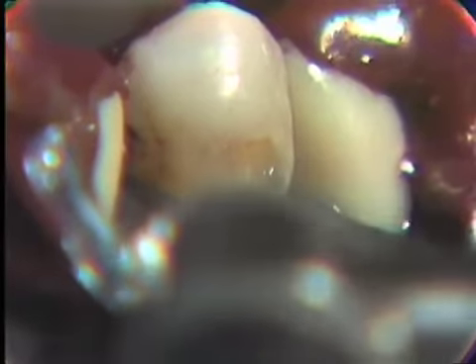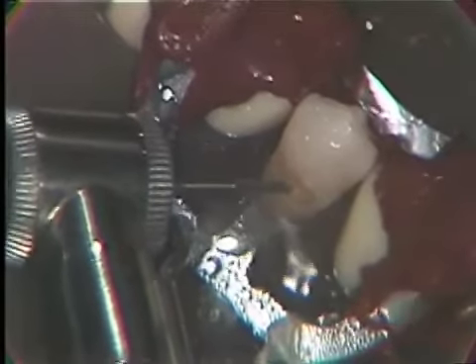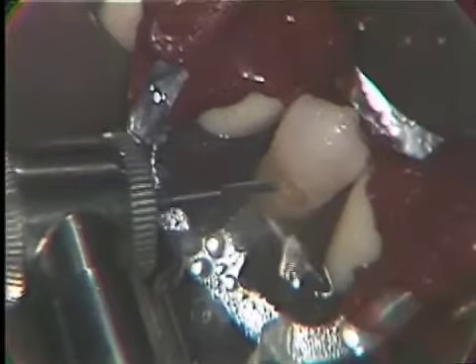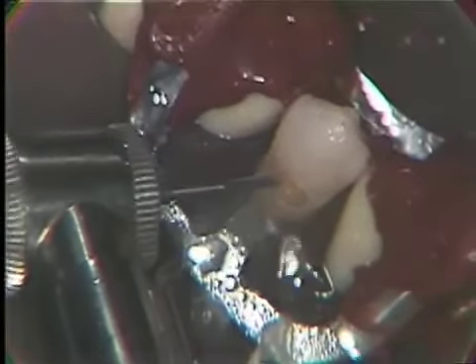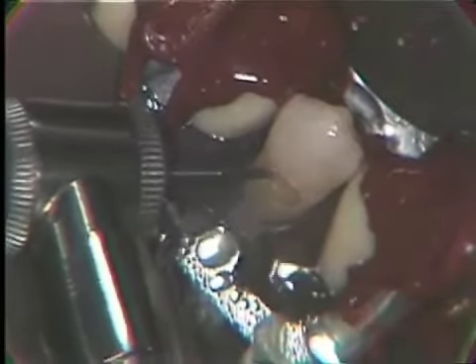Coming over to the distal now. Once again, establishing a cavity preparation that will have its mesial and distal sides rounded. It resembles somewhat the Ferrier type cavity preparation in that the occlusal wall is longer from mesial to distal than is the cervical wall. Now we're coming over to the distal to rid that particular area of the decalcified enamel.